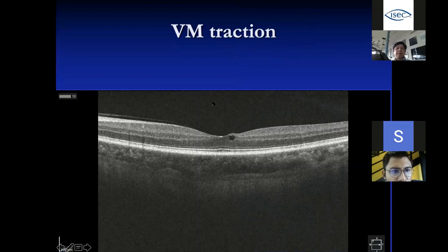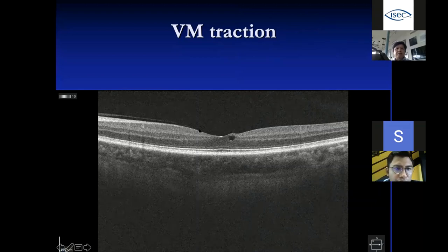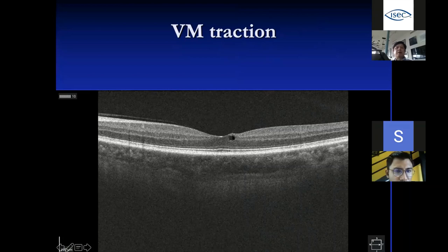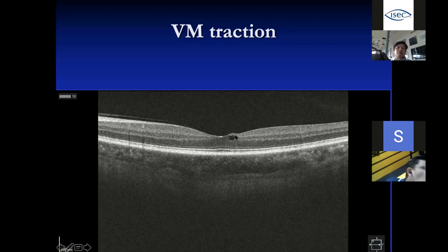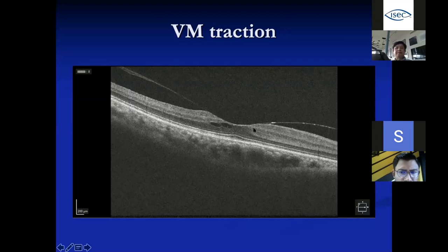Related to ERM is vitreomacular traction (VMT). You can see a line at the interface where the vitreous jelly adheres to the macular region in a V-shaped pattern. As the vitreous contracts, it can pull on the retina, causing traction. This patient may be asymptomatic, and when we see this we watch carefully for any distortion or visual problem. In a more advanced case, broad adherence of the vitreous to the macular region causes distortion and cyst formation.